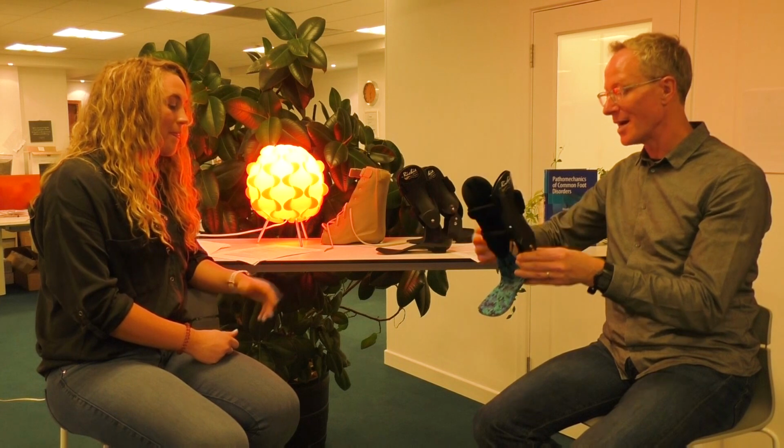The challenge with those really advanced lateral unstable ankle joints is that they become arthritic. That's where those joints are going, and at that point the fixed hinge is much better than the standard. Especially with the treatment plan, as I said at the beginning, it's great to use it to offload the lateral structures while doing rehabilitation, and we'll have an example of rehabilitation that we would use with this device.